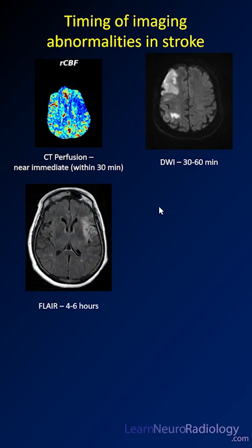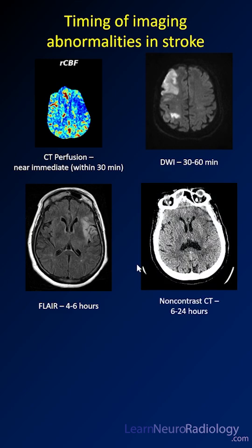Within about four to six hours you develop edema in the tissue. That becomes visible on FLAIR within about four to six hours. Here you see some edema in the insular region and inferior frontal lobe there.